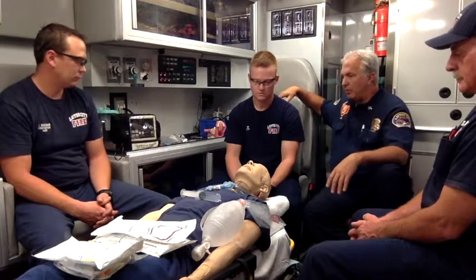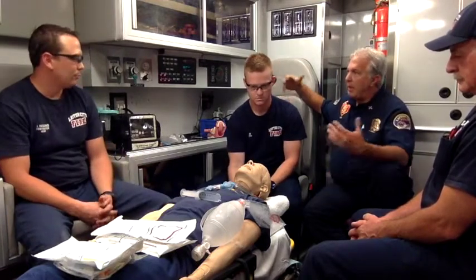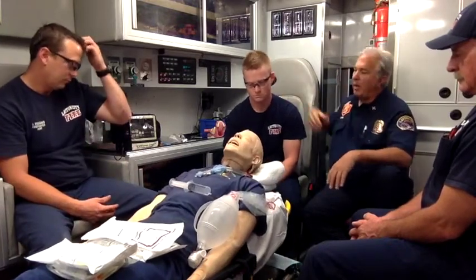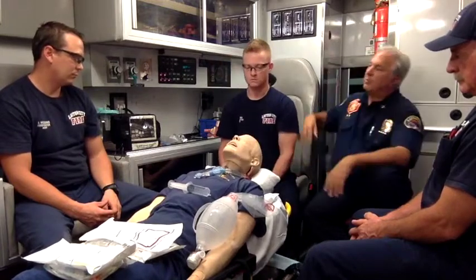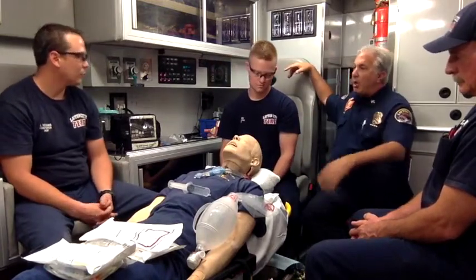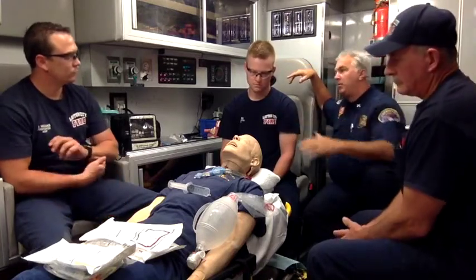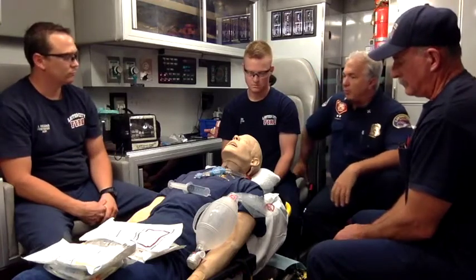So how are we going to do this? On the gurney, that makes it super easy, right? Yet another reason, go ahead and do it. We want to be about 30 degrees, right? And then have the head basically parallel to the ceiling, that's going to be right there, okay? So now, all that stuff that's in there is going to stay down there. They're not going to puke. It's not going to do that purple puke thing that you've heard me talk about before, all right?